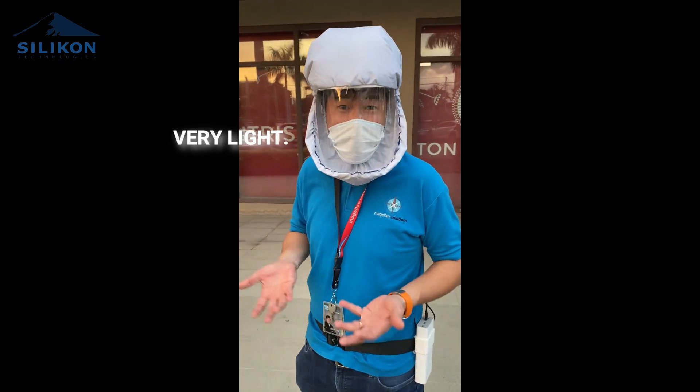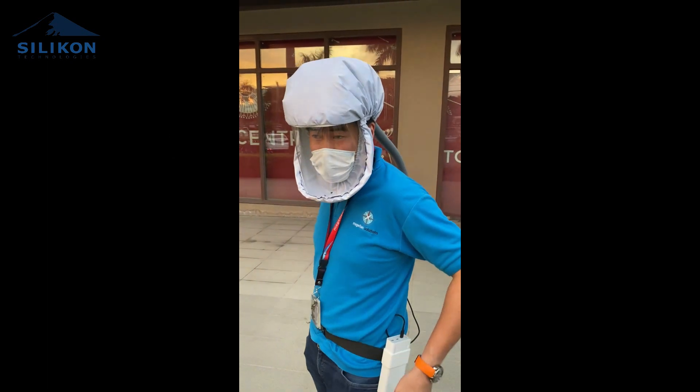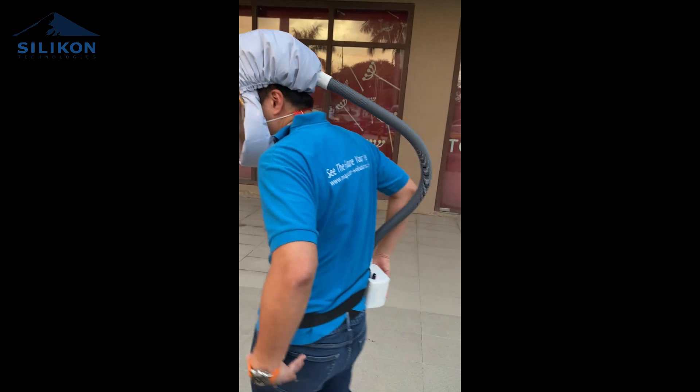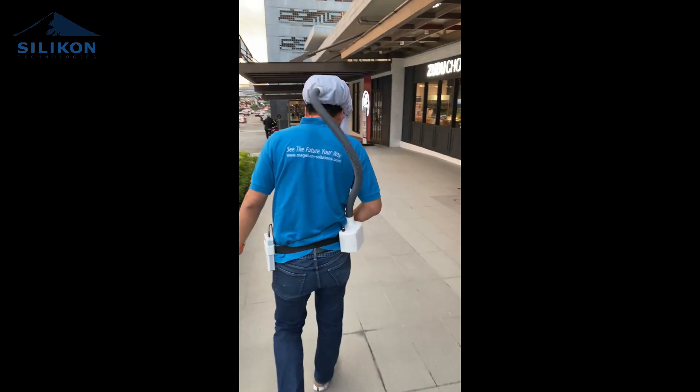It's very light, even if you wear it for several hours. It's good because you can distribute the weight of the power unit at the back end with the air tube. And here, breathing while wearing it like this — it's a lot more comfortable.